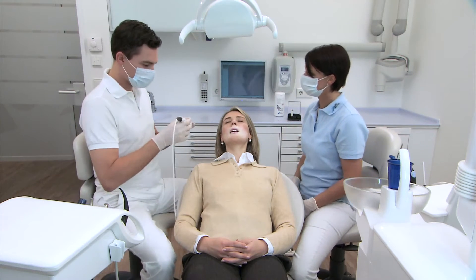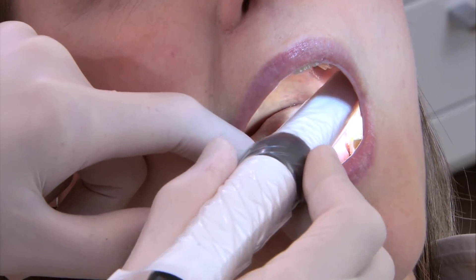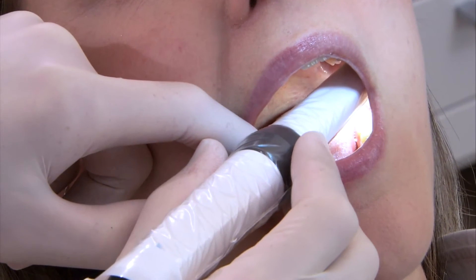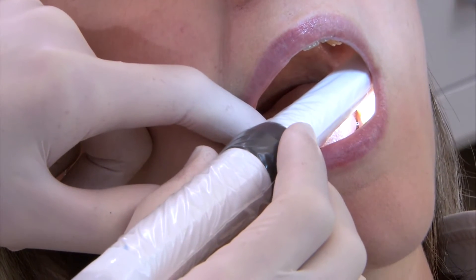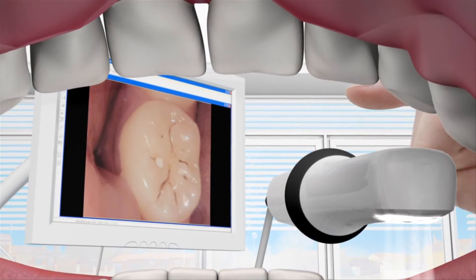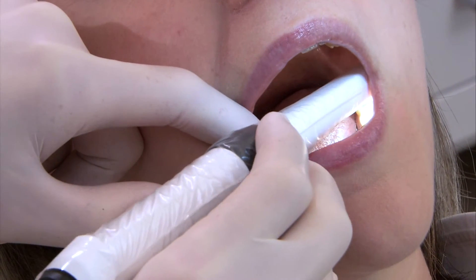Whether taking still or live images, video clips, or for memory storage, using the manual trigger you will be able to work in a relaxed and ergonomic way in all treatment situations. A simple press of a button is all it takes. The practitioner rotates the camera, not his or her hand.